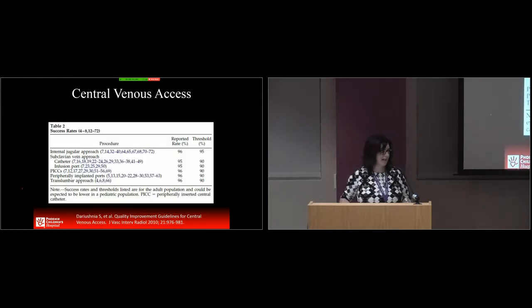And then for success at accessing veins, it's very high using imaging guidance. So when we place lines, we use real-time ultrasound guidance. So we're watching as the needle or the angiocatheter goes into the vein to reduce the risk of complications from accessing, including pneumothorax, hemothorax.